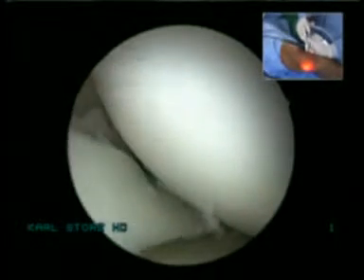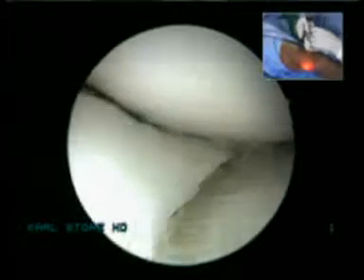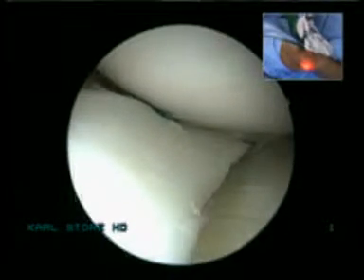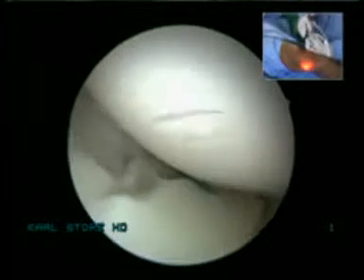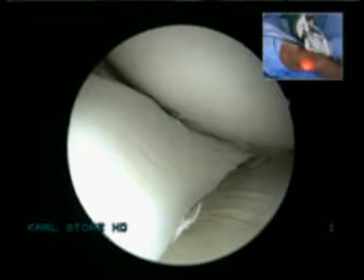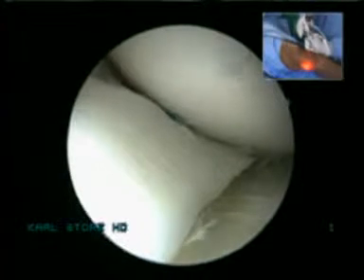Okay, and what are your quick criteria for that? I prefer red zone. So do you think a tear of this sort would fall in that criteria? It looks a little more towards the white one. But he knows better, who is operating there. He must have probed it and seen it.